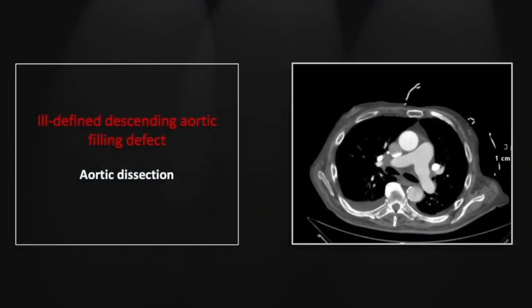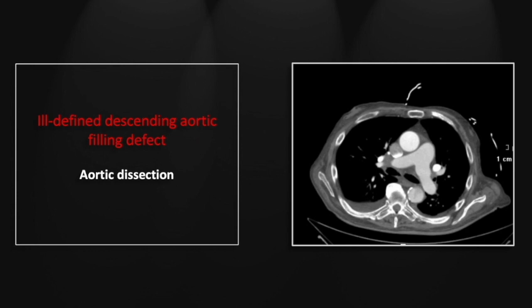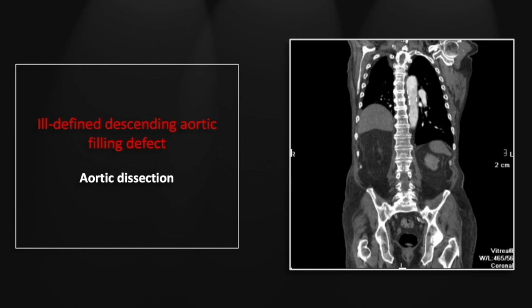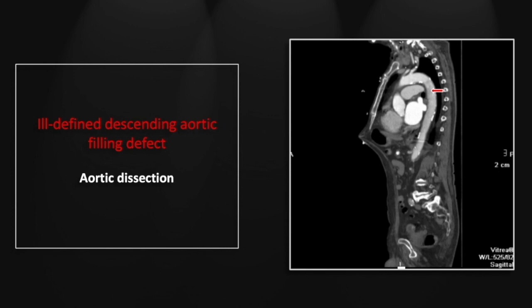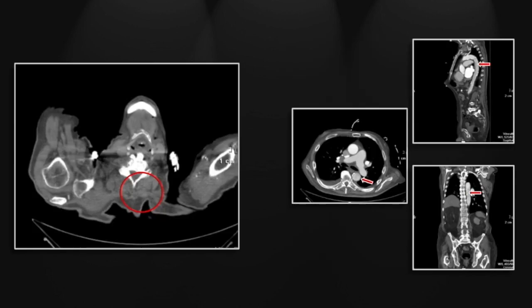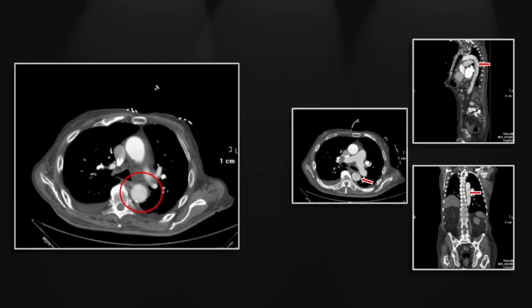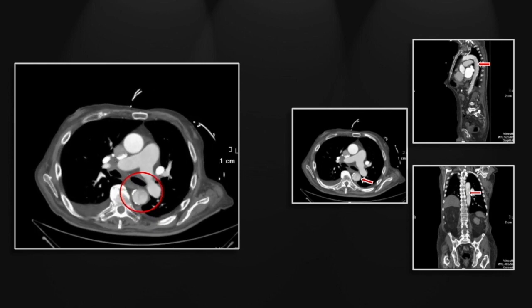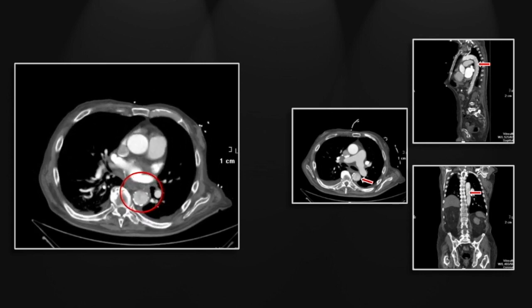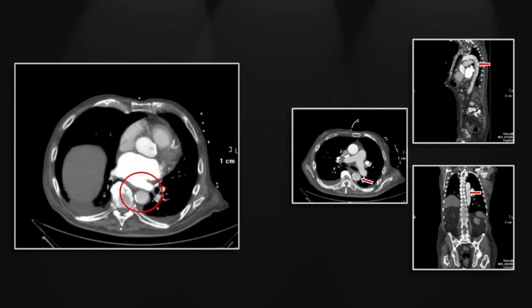Our next case is another aortic dissection. The previous case sets you up to appreciate this one, where there is a very faint but again dynamic and ill-defined filling defect in the descending thoracic aorta — a little better appreciated on the coronal and sagittal views. You can see it beginning there — a typical type B dissection. On the axials you can see it is very dynamic, pulsing in the systolic breeze and moving all about the lumen of the aorta.